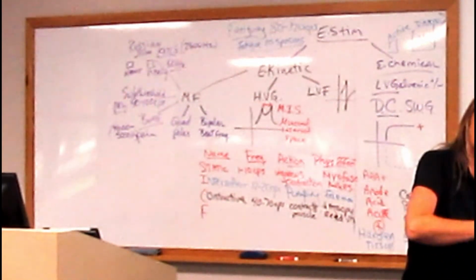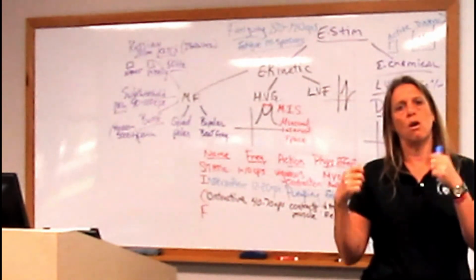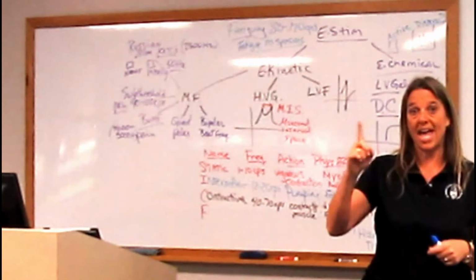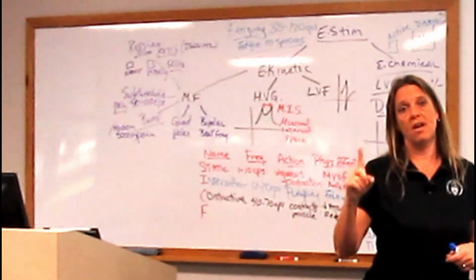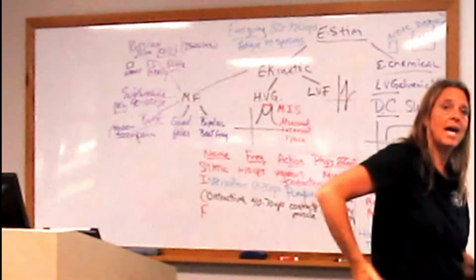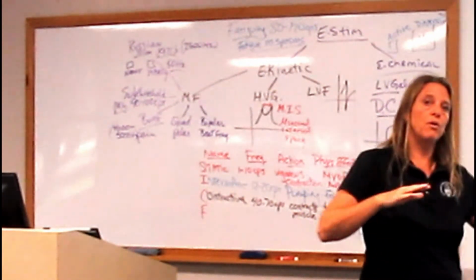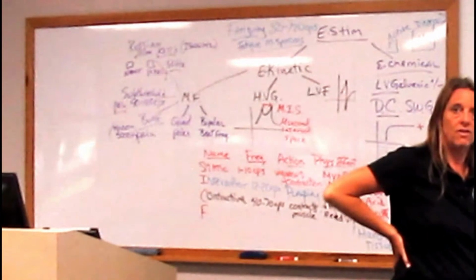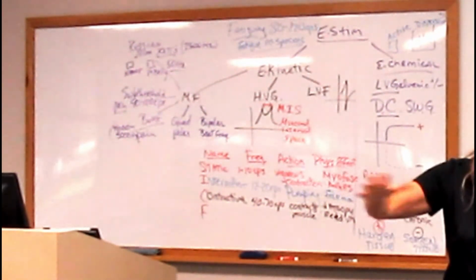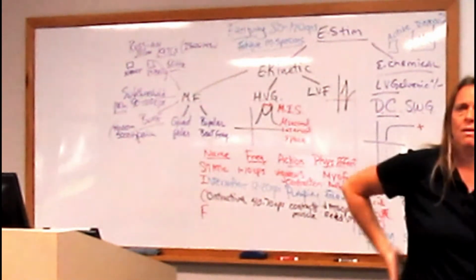And when you're using Chattanooga or any of these machines, you have to figure out which is the active lead. So the new Chattanooga that I've been showing here, the red on channel 1 is your active lead. So you put that right here. Then you put a big pad on the back. And that will make the back not get very much base, because if acid's going here, base is going there. And you don't want the base to accumulate in a place that doesn't need treatment.